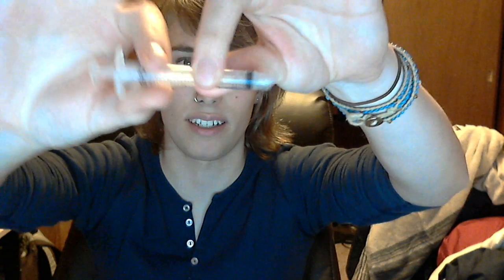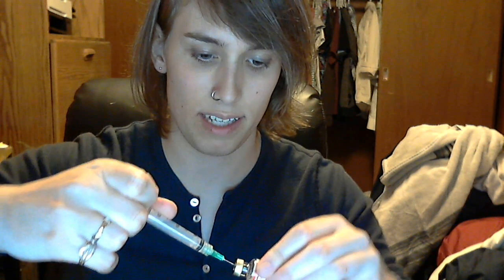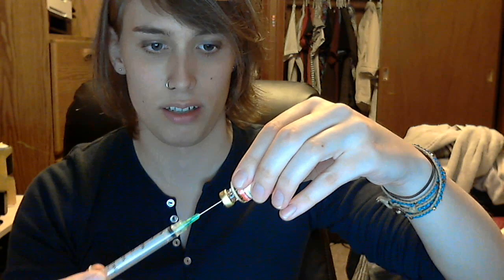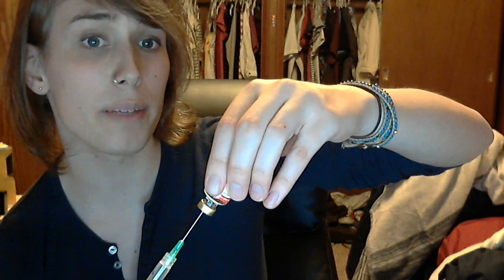First of all, I use 3 milliliter syringes, and you draw the plunger back about 1.5 milliliters, because that's how much I'm going to end up wanting to have in there. And then I put on my longer needle. I've got my little bottle here, and I stick it in there. Then you squirt the air in, because you're going to be displacing that much of the fluid. That way it keeps it at the normal atmospheric pressure inside the bottle or something like that. I just pull the plunger way down, and then you just gotta wait for it to flow through, because it takes a really long time.